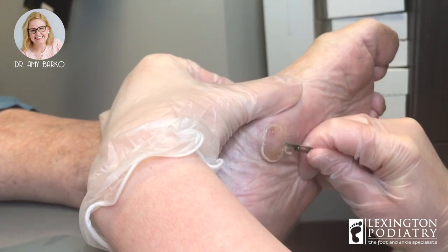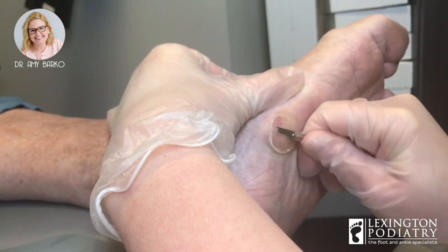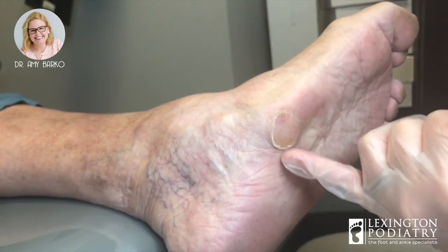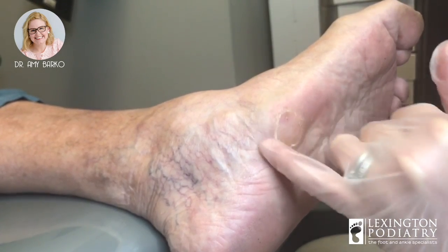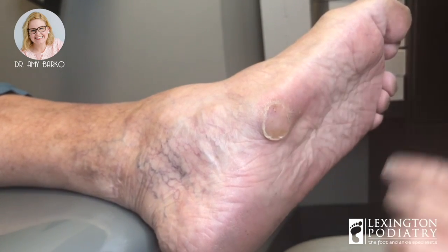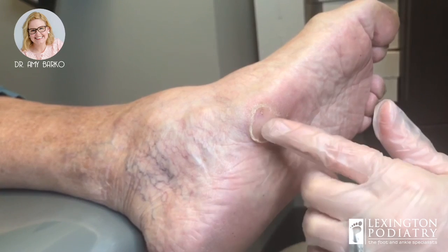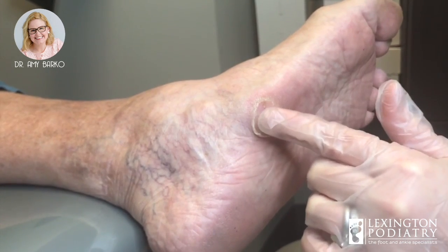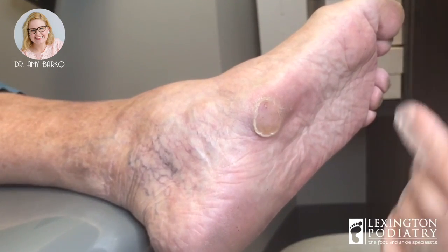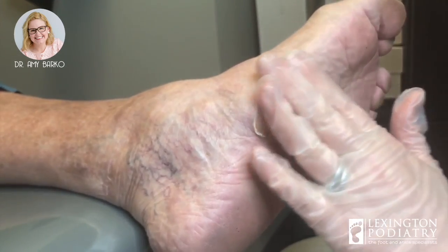We are trimming a callus — we've done part of it here. We also use a Dremel afterwards. See how we've got a little bit of an edge here? We're going to smooth that out with the Dremel. Calluses sometimes help with pain, and sometimes they cause pain. I'm now down to normal skin. I don't want to make her bleed because that does cause pain. My goal is to get her to a comfortable place and then smooth her down.